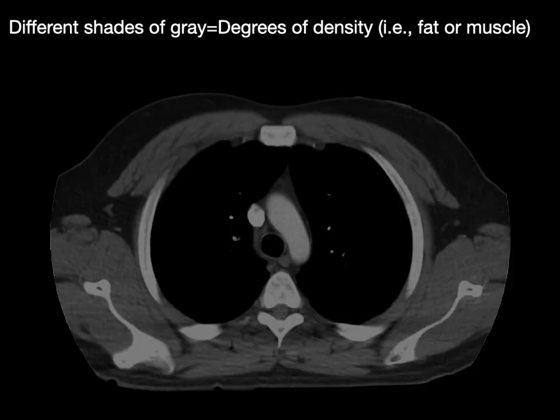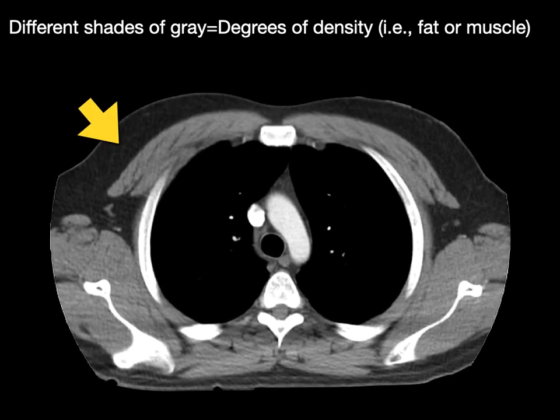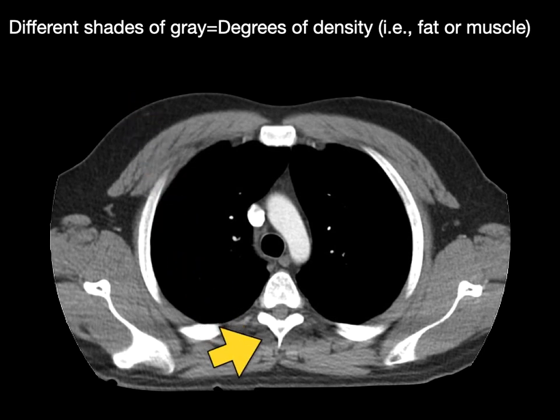The different shades of gray show varying degrees of density and attenuation. Fat shown in the subcutaneous tissue has a lower attenuation than the pectoralis major muscle, which is a little more dense but not as dense as bone. There are also paraspinal muscles visible.